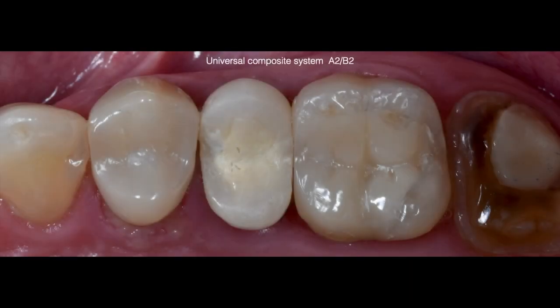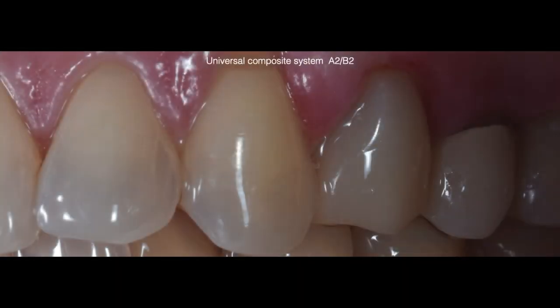And here is the photo after occlusal adjustment and polishing using the Shape Guard system by Coltene. Again, the restorations have the right opacity, even though for tooth number 12, it is a full crown that was restored. On this side view of tooth number 12, again, look at the dentin-like opacity that mimics the surrounding natural dentition.